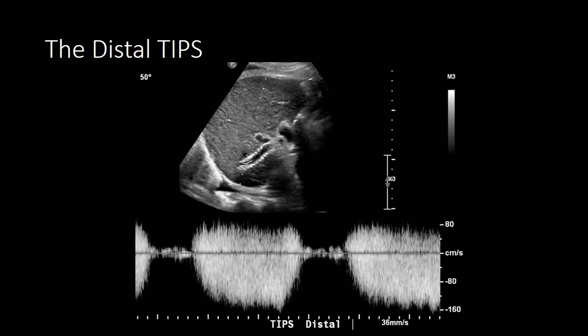Okay, here's an example where someone is interrogating the distal tips. And I wouldn't say that this isn't within the distal part of the tip stent, but it's pretty close to the junction of the mid portion of the tips and the distal tips, as opposed to that terminus of the tips, the very end of the tips.